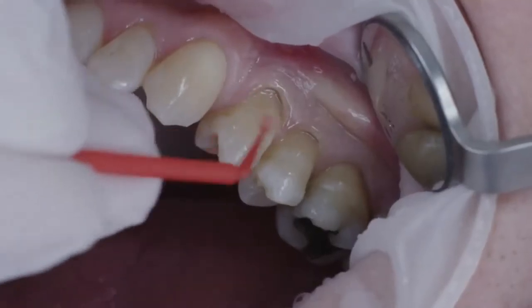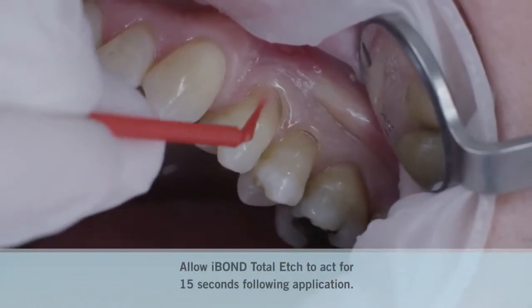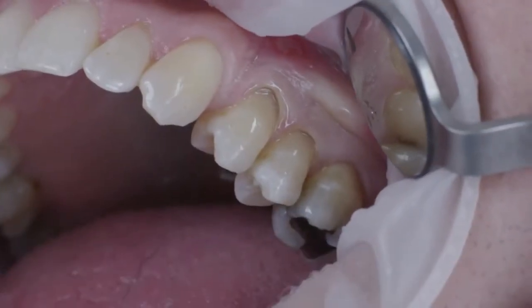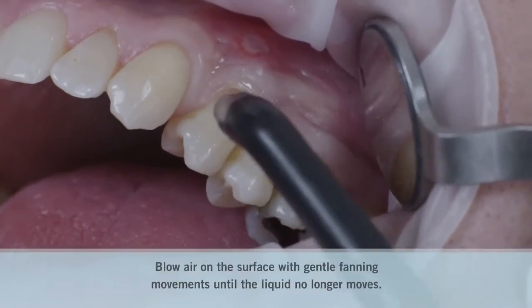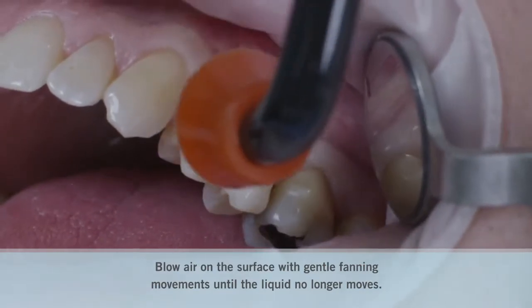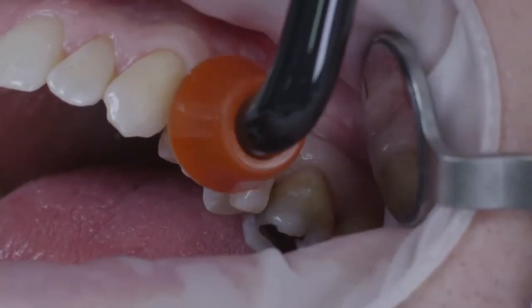In accordance with the etch and rinse technique, I-bond total etch was applied to the tooth surface. This product does not need any agitation. After the corresponding application time, air was blown on the material beginning at the enamel and moving towards the dentine until an even glossy surface is achieved, which was then light cured for 20 seconds.